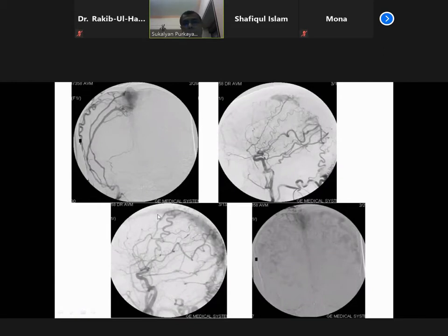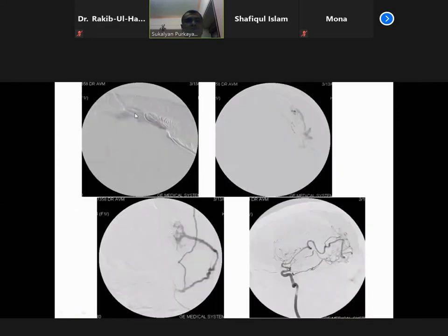And what you need to study is whether the normal brain is taking the superior sagittal sinus or not. If the normal brain is not taking the superior sagittal sinus, you are happy, you can go ahead and block the fistula either through the transarterial route, or, if your distal part of the transverse sinus is open, which in most cases it is not, because the fistula mainly develops because of distal transverse sinus narrowing or thrombosis. And then in that case, either you take the transarterial route or make a burr hole here.